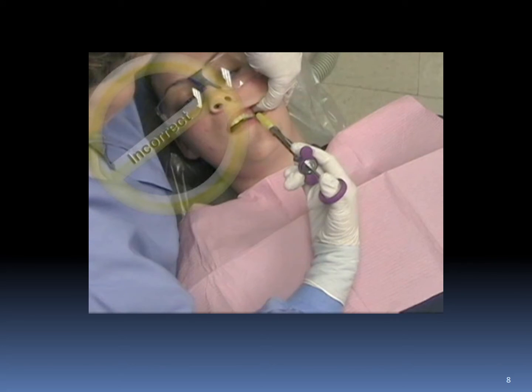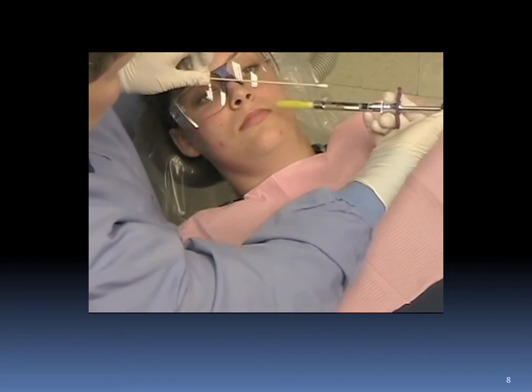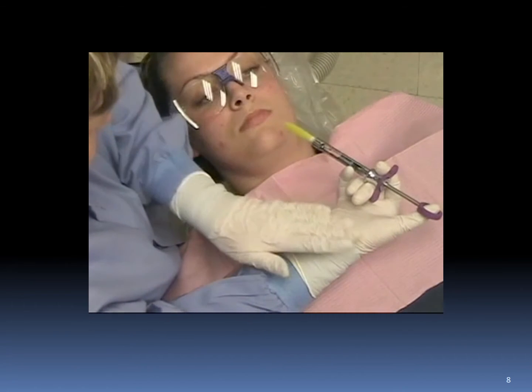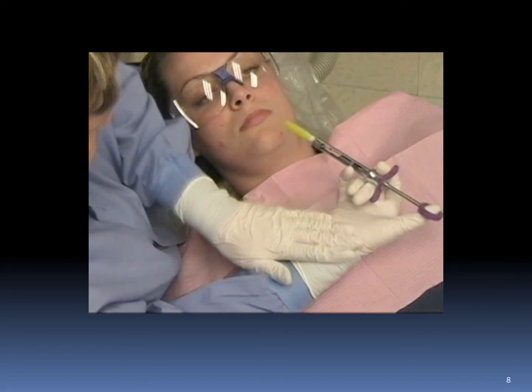One solution to this is to hold the syringe in a palm-up position. This will align the syringe at the desired 45-degree outward angle as demonstrated here. Looking more closely, note that the syringe is balanced between the fingers and the palm is facing upward. This will allow the clinician to maintain both proper ergonomics and injection angles.